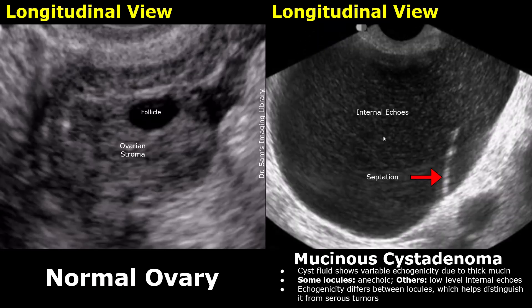This image is also of a mucinous cystadenoma. They are mostly multilocular and will have low-level internal echoes in the mass. This mass has a partial septation. The main feature is the presence of internal echoes.